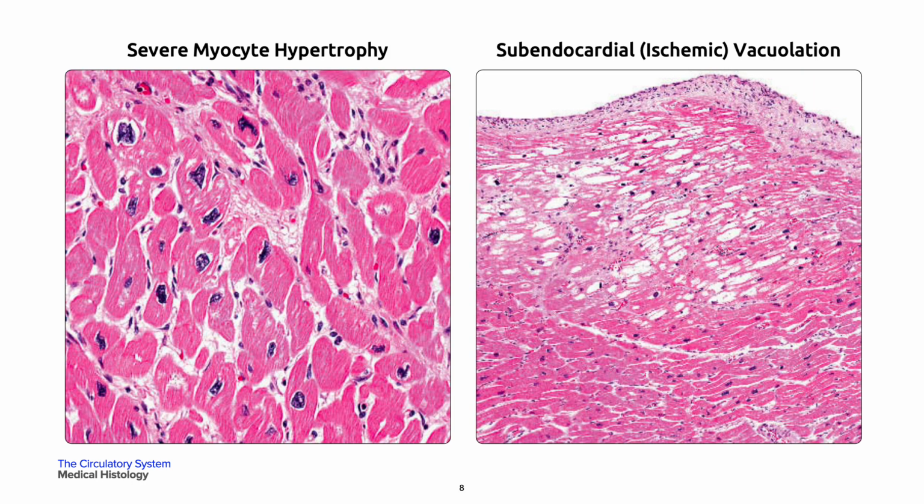On your left is a severe abnormal hypertrophy. The nuclei are dramatically enlarged, hyperchromatic, and irregular. You also have to note the absence of mitosis. Nuclear features are a more reliable measure of hypertrophy than other cell width measurements due to the complex 3D architecture of your cardiomyocytes.